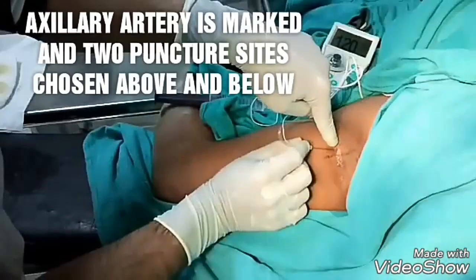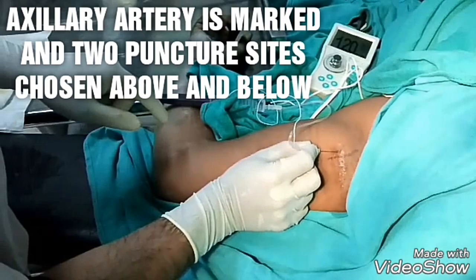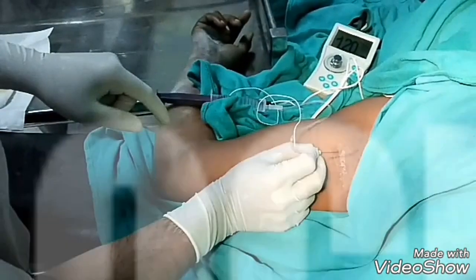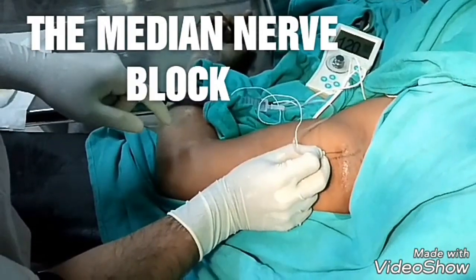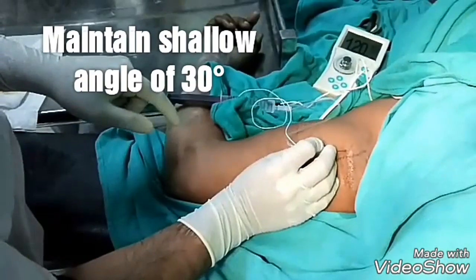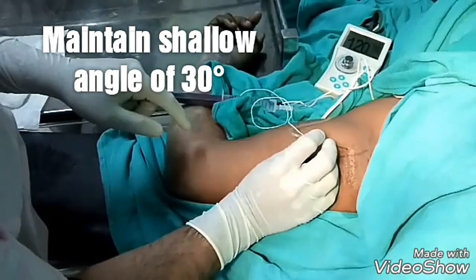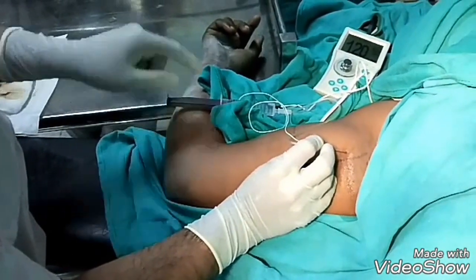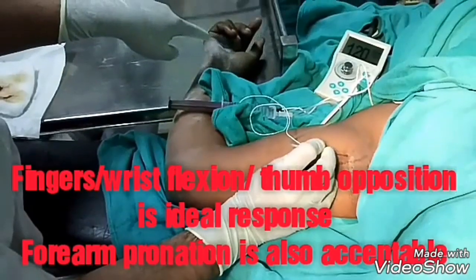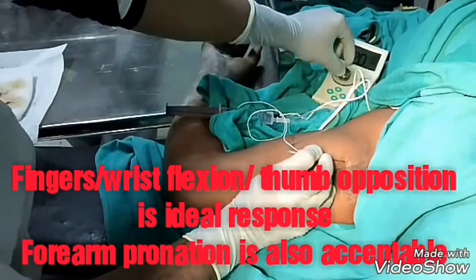This is the axillary artery. One point chosen above, just a 30-degree angle — I am going in and resetting for the median nerve. This is the median nerve. I have got the median nerve.